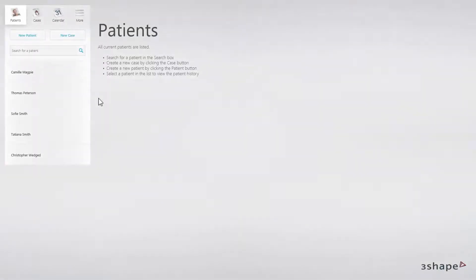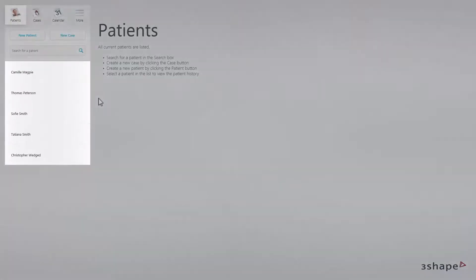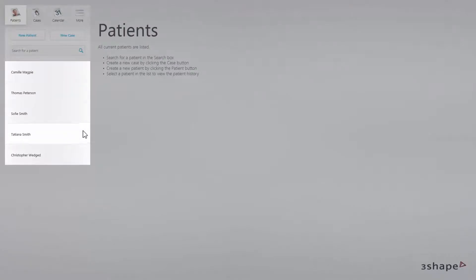After you have logged in to Implant Studio, you start by creating a new case. To do that, you need to have a patient selected. You either choose an existing patient or create a new patient.